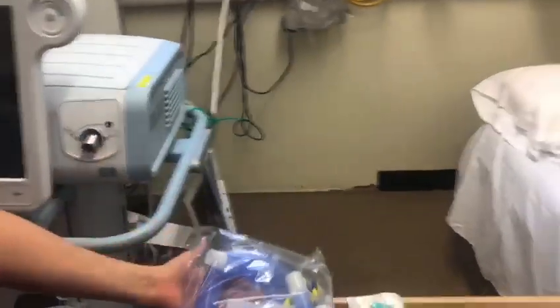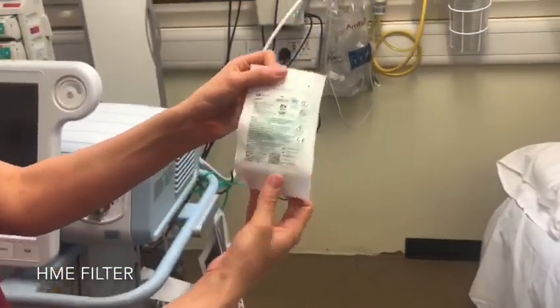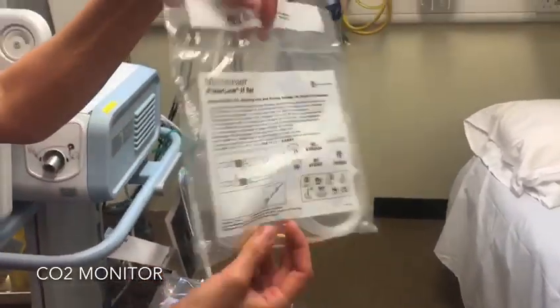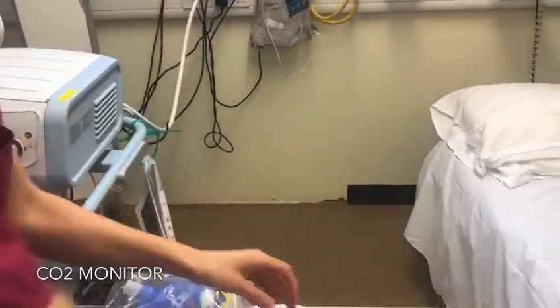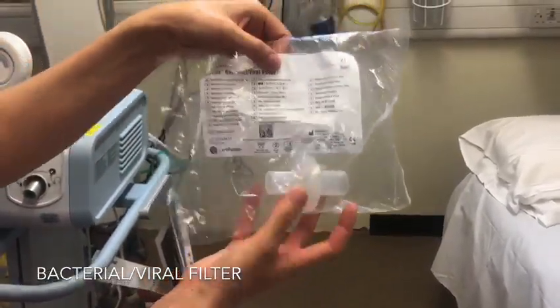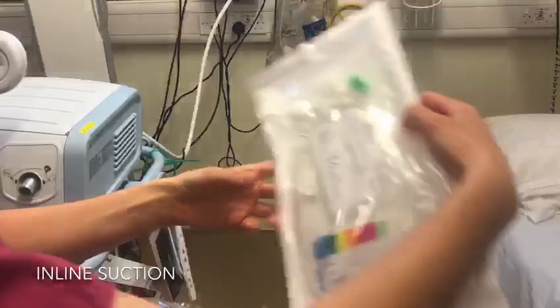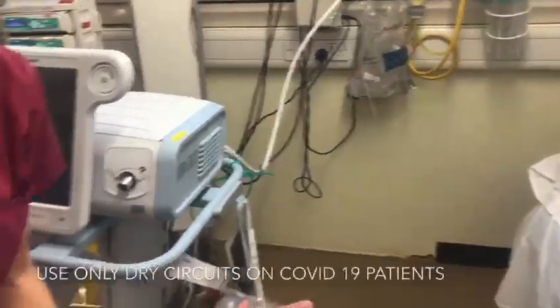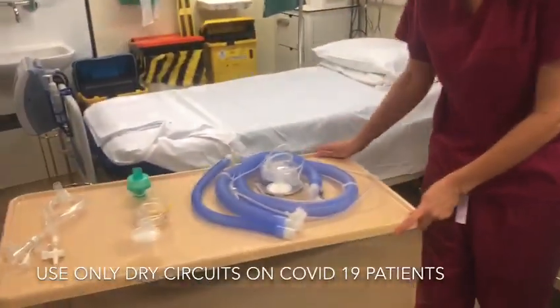We also need a HME filter, a CO2 monitor, a bacterial viral filter, and some inline suction. When you take those out of the packets, they will look like this.